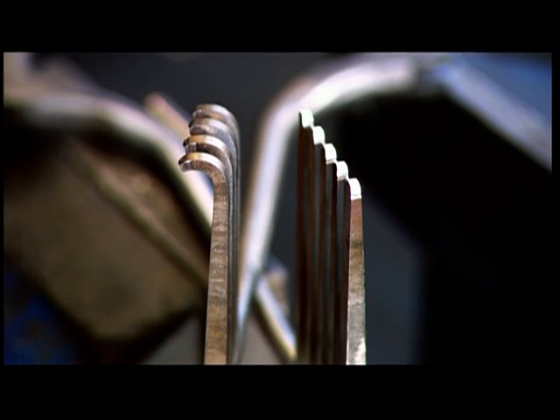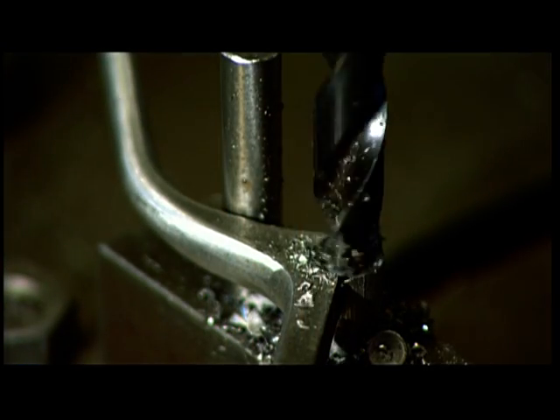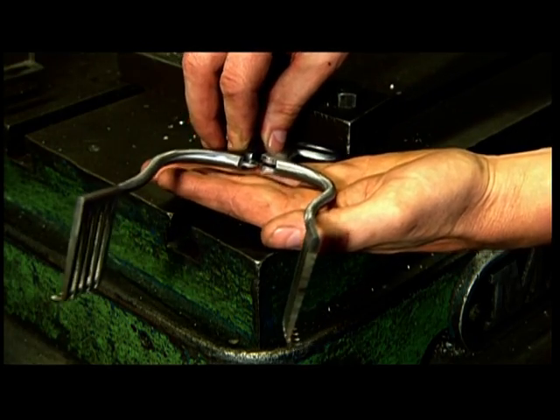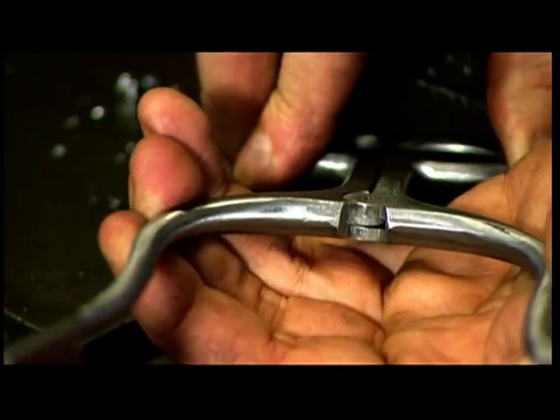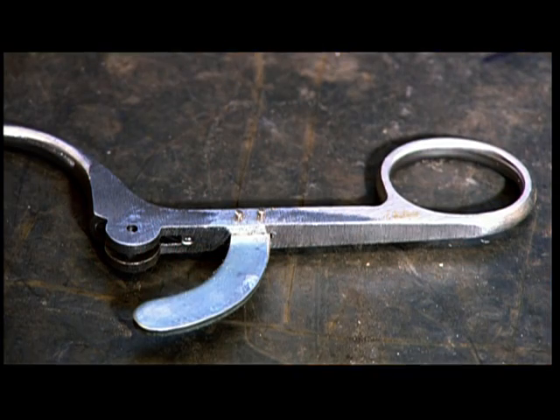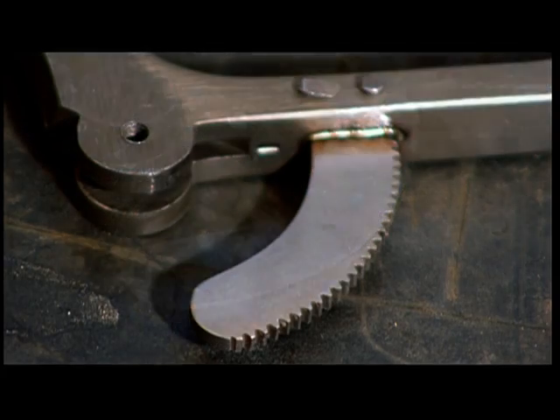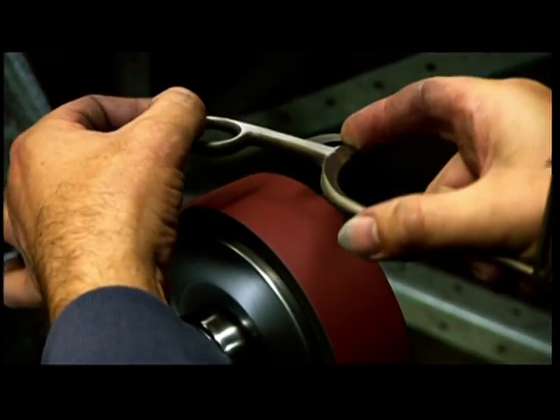With the teeth now complete, attention returns to the round joint of the instrument. The carved slots and countersink allow the two sides to fit together perfectly. They install a part called the rack below the joint and file teeth into it. It will be used to lock the tool in an open position.